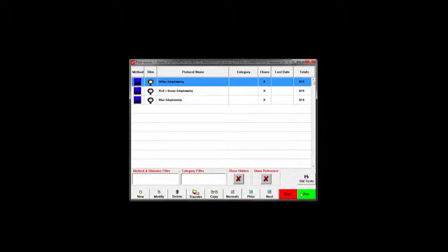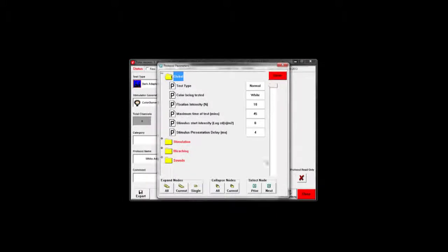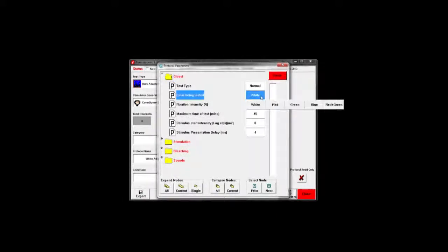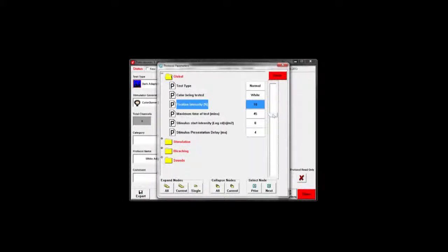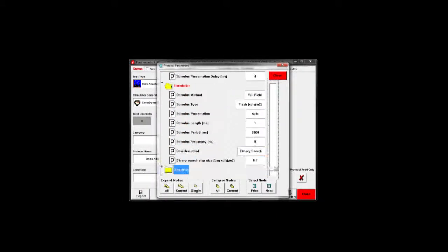If you wish to edit the protocols you can press modify and change parameters that control options such as bleach intensity, maximum length of test, and the colors being tested.